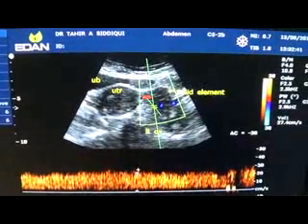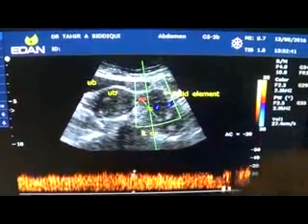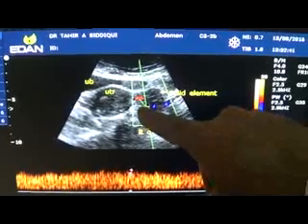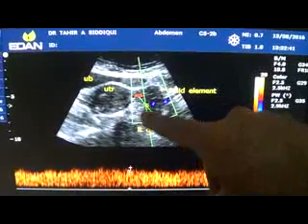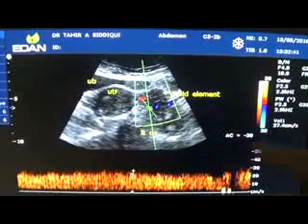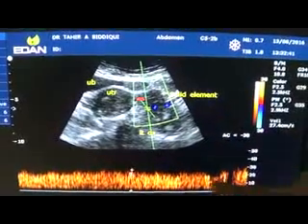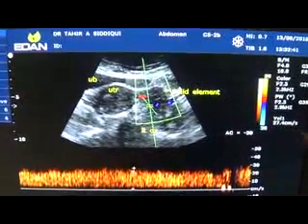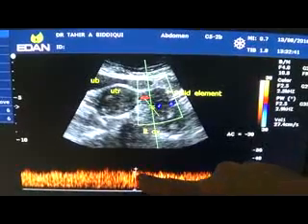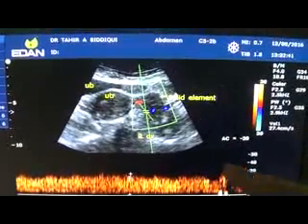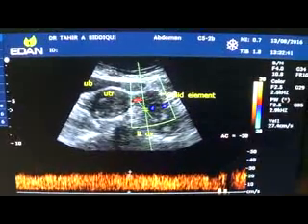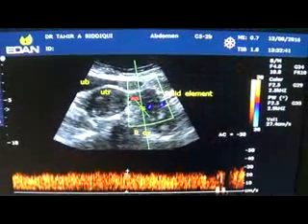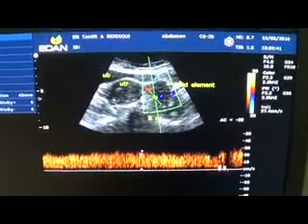This is the urinary bladder and this is a part of the pathology that I will show you. This is the solid component within it, and it contains vessels — the velocity of the vessel is 27.3 cm/s within it. Within this solid element it is 27.4 cm per second, which is to be considered significant because this is a very high velocity regarding the solid element within a cystic mass.